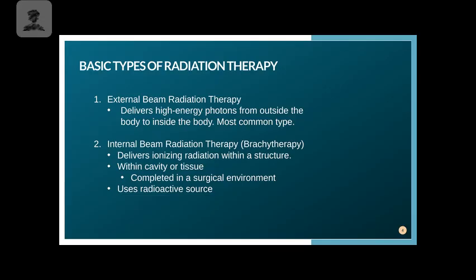The second type is internal beam radiation therapy, oftentimes also called brachytherapy. This one is, I would say, not as common, and the only reason I say that is because you have to have a specialized treatment machine and a special environment, because it's more like a surgical suite many times. Where I did my radiation therapy clinicals, they didn't even have brachytherapy as an option. They had to go to a separate facility with a different oncologist if they wanted to receive that type of treatment. What happens is we are delivering ionizing radiation within a structure.